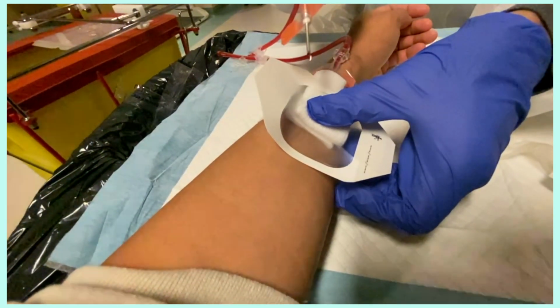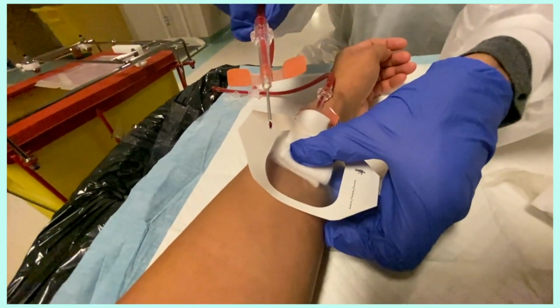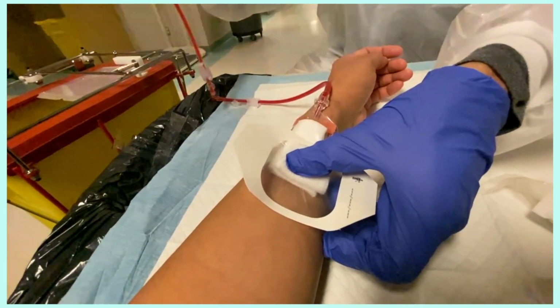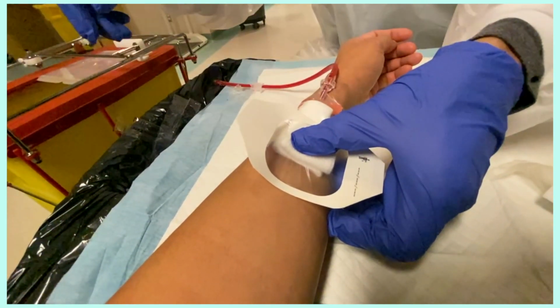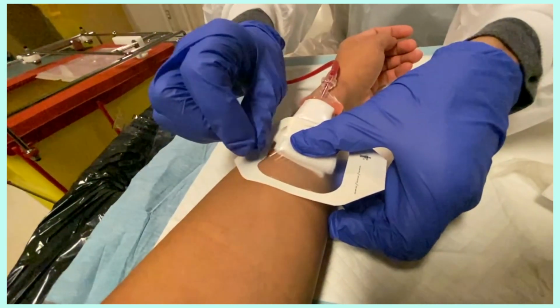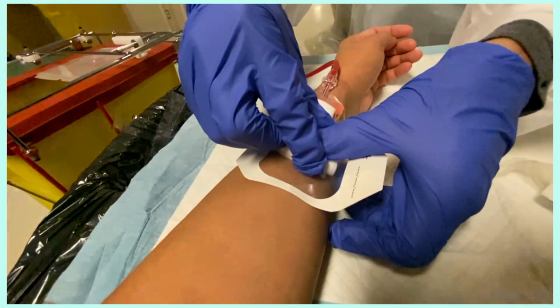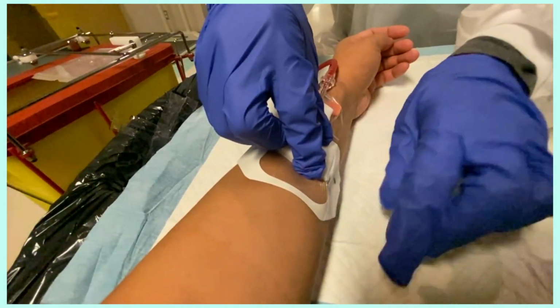I think it's supposed to be like these buttons where the needle takes itself out, but not every nurse does it, like she didn't. It can be painful if they just pull it out like that, but this particular time it didn't hurt, which I'm glad, but I'm not gonna lie to you guys, sometimes it does hurt. And I'm grateful for the nurses that use the button.